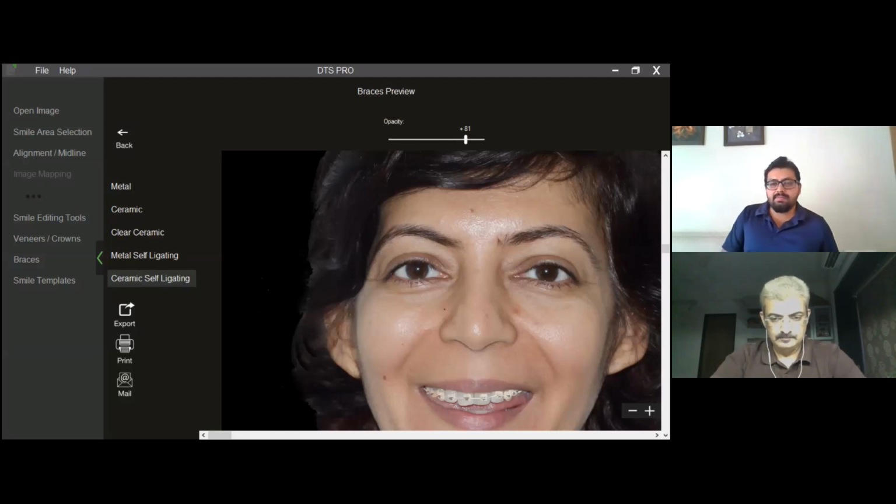Whenever the patient sends you a photograph on a virtual medium, you can definitely use it to simulate. But there is still a little bit of a limitation, because patients might just send a selfie taken at a not so pleasing angle, and working around a distorted photograph takes more time, and you might not end up with simulations which can actually convey the message.